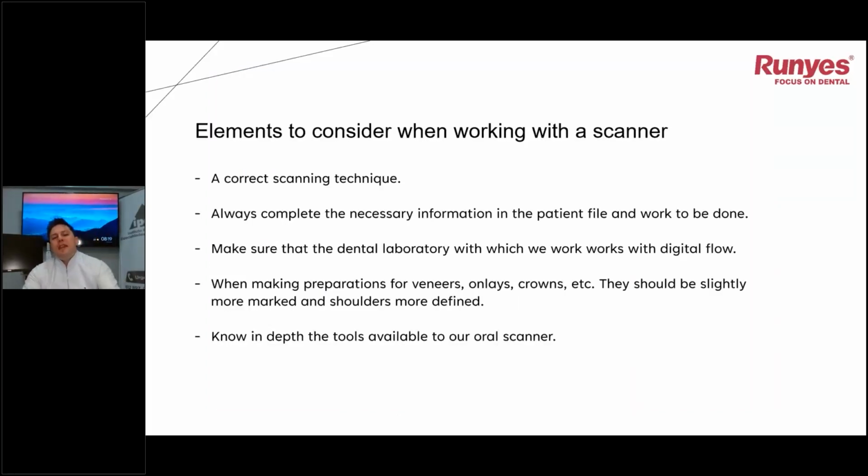What are the elements that we have to consider when we are working with a scanner? First of all, it's a correct scanning technique. If we don't take a correct analogic mold, a normal silicone mold, and we don't have the clinical expertise to know how and when to take a mold, it's the same with a scanner.